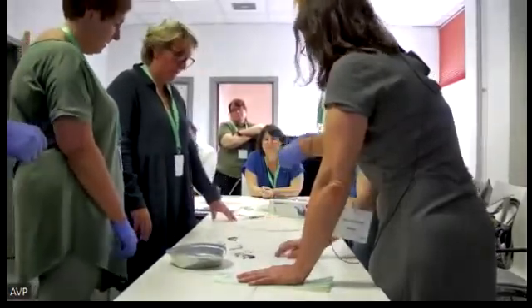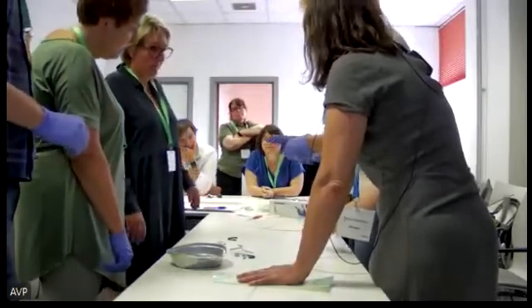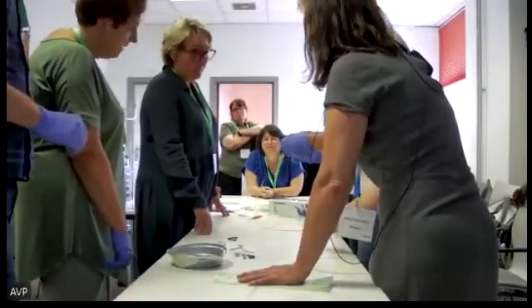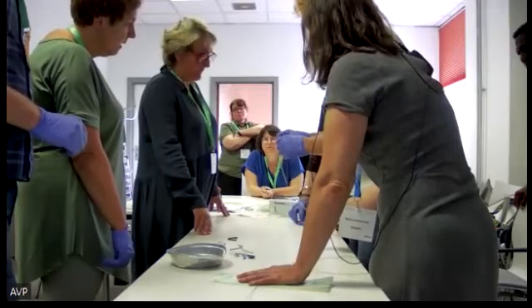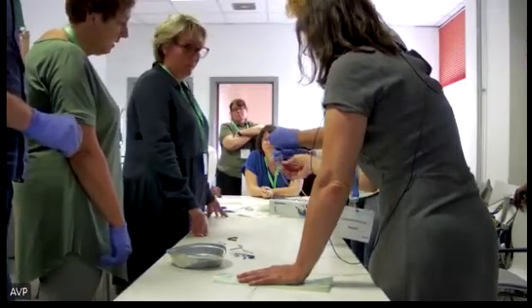This is the endoscope here. It's going to the valve. And then the physician pushes the system alongside the wire.